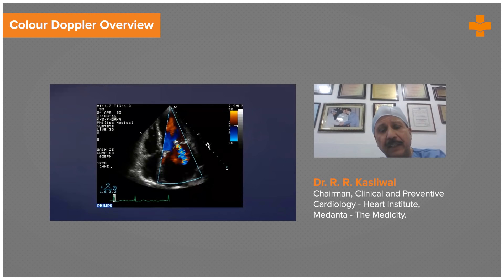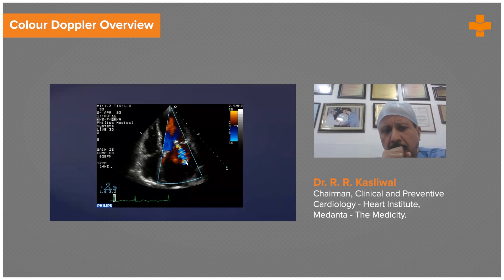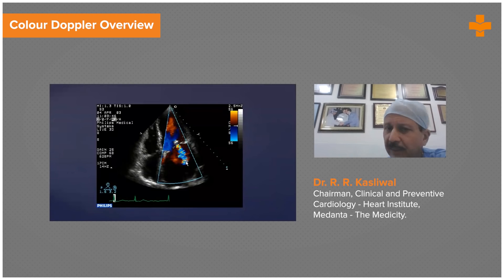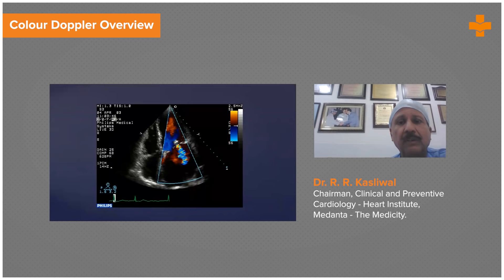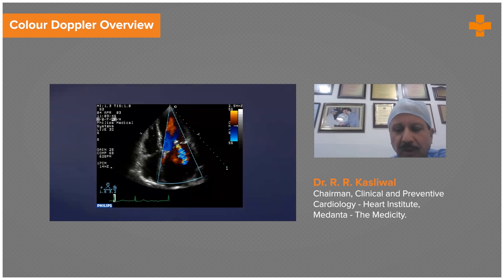Color Doppler — you can see very clearly the left ventricle, the enlarged left ventricle, and the flow of blood into the left atrium. This is regurgitation. Without putting any dye into the left ventricular cavity, you're actually able to define mitral regurgitation. The same thing you can do for TR, and TR is important because you can actually define PASP pressure. Hemodynamics is another area — you can tell your clinical cardiologist that here is a patient whose PASP is high, IVC is dilated, tricuspid annulus is wide, probably has a dilated cardiomyopathy.